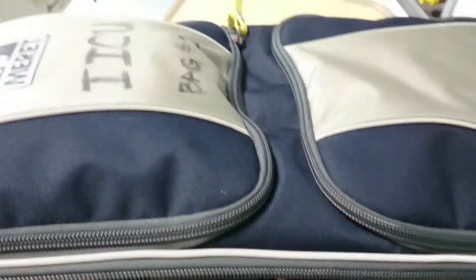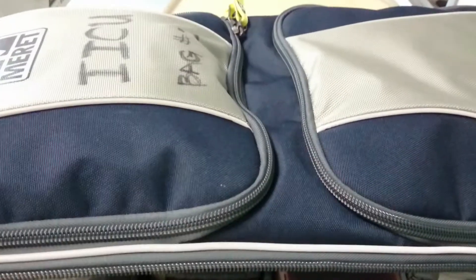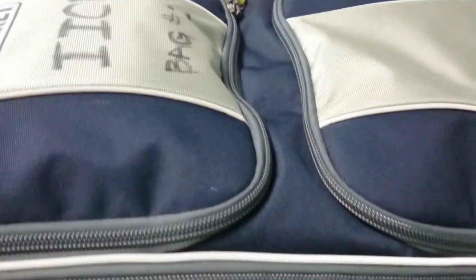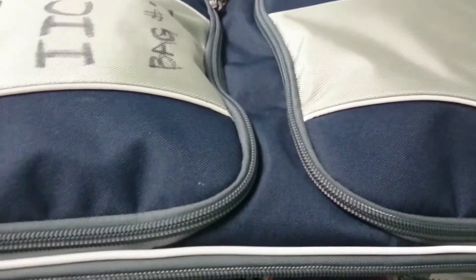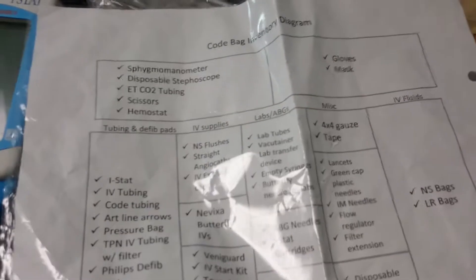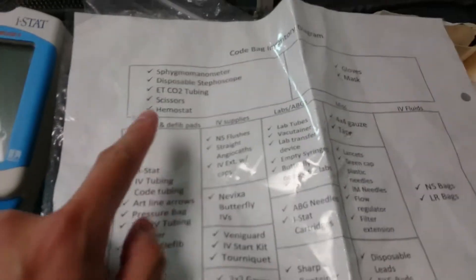This is the orientation of the IEC code bag. This is just to make sure that we all stock everything in a pretty similar fashion and to kind of show you why we designed the bag this way. There is an inventory list that sits right there. This breaks down where everything is and gives you a little heading of why things are placed here.